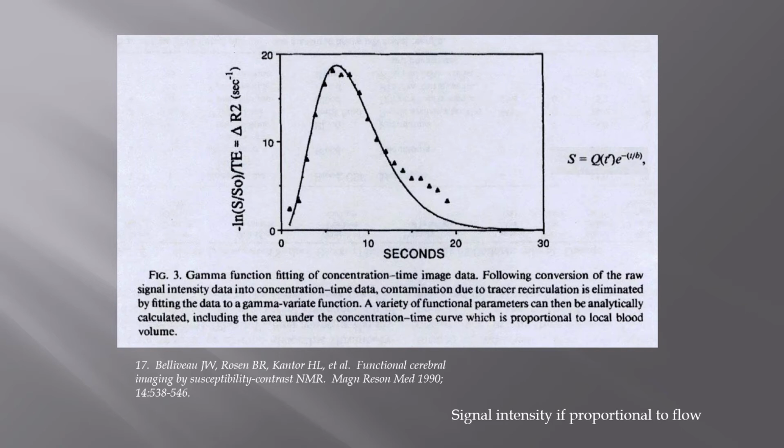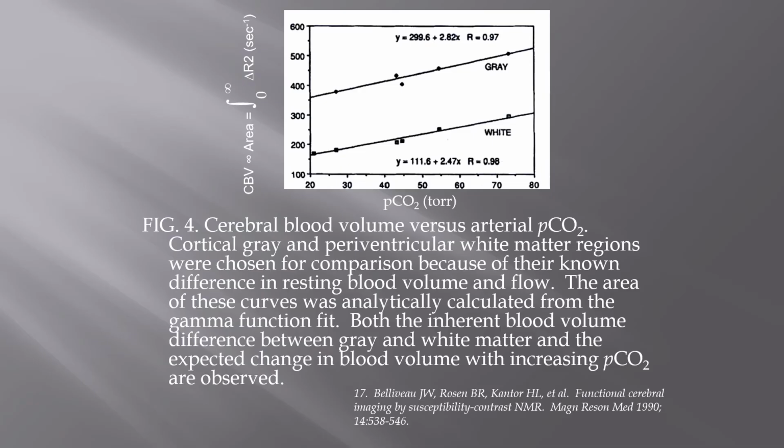So then if you flip that curve for analysis, the contrast signal is going up. And then that's if you approximate it. You have some problems here. You get some recirculation problems likely coming in and contributing to not having a perfectly optimal curve for the perfusion analysis.